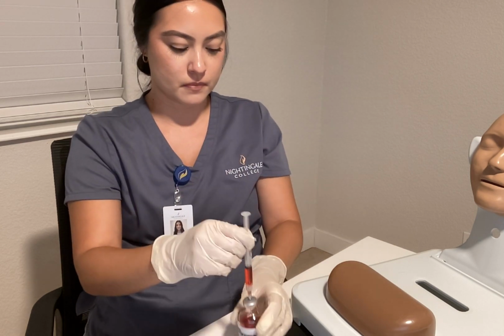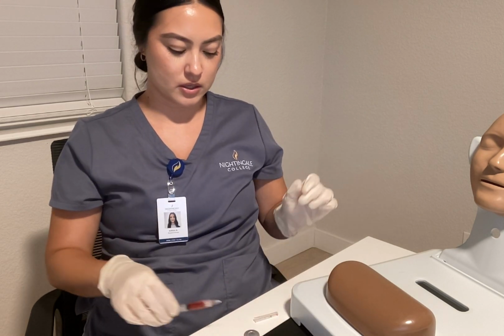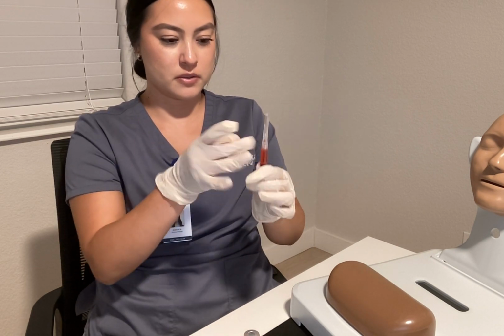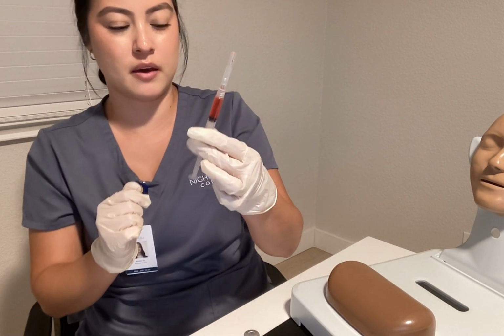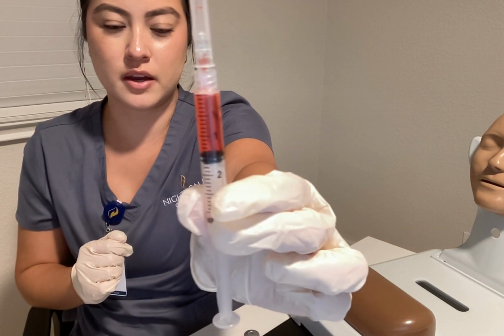Perfect. I'm just moving this needle back here so you can see. Okay, so we do have a little air bubble. Okay, so now we have 1.5 of our medication there.